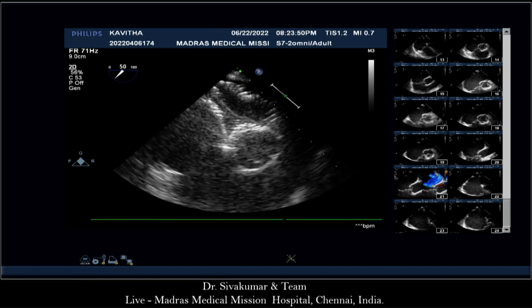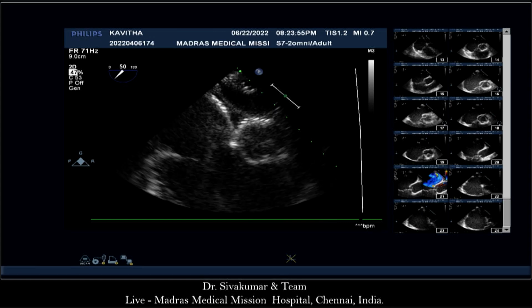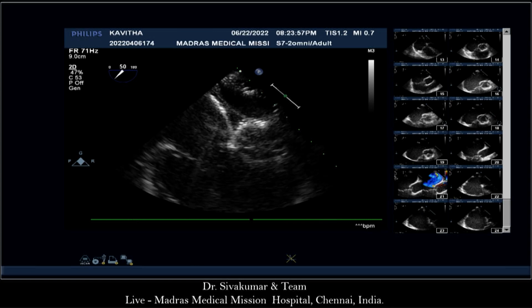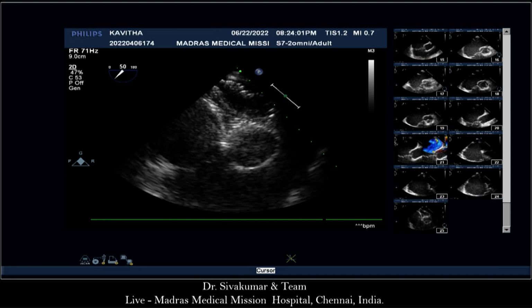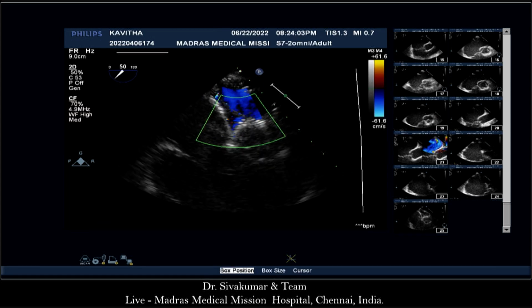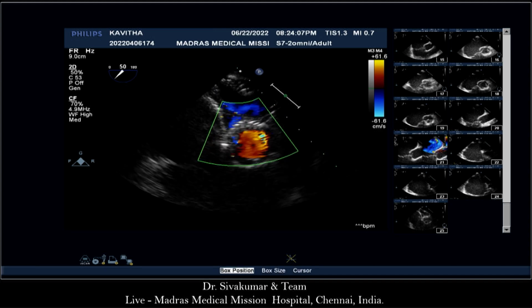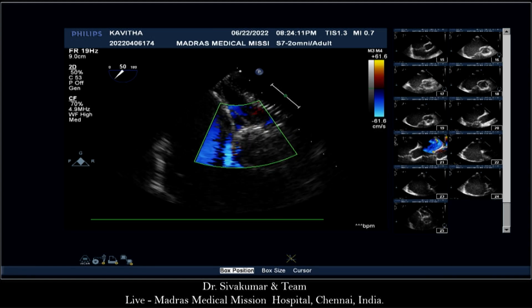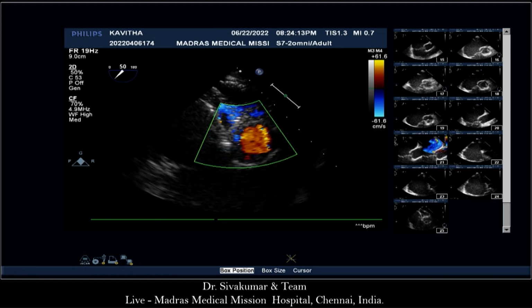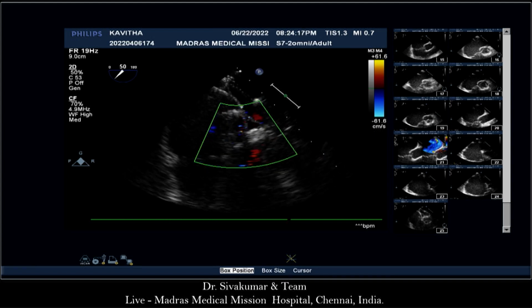Nicely pull it out. Let's see four chamber view, see the mitral valve. We will do that. So the anterosuperior margin is slightly flared. Come out, Srija. Okay, start coloring from here, only the anterior margin. Now make it narrow. Okay, keep progressively pushing inside. Perfect. Keep on going inside. I'm going in. Now we are going to get the mitral valve.